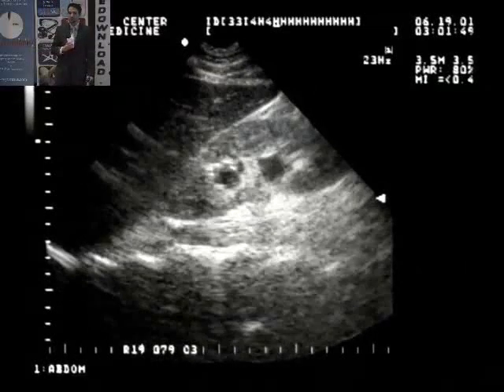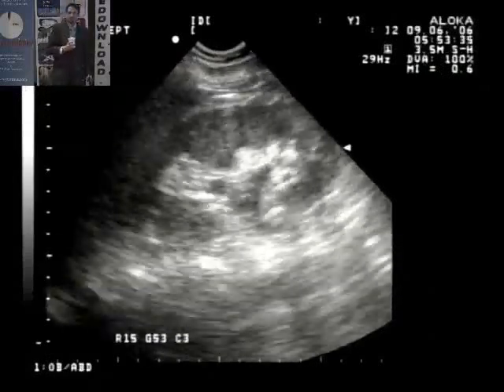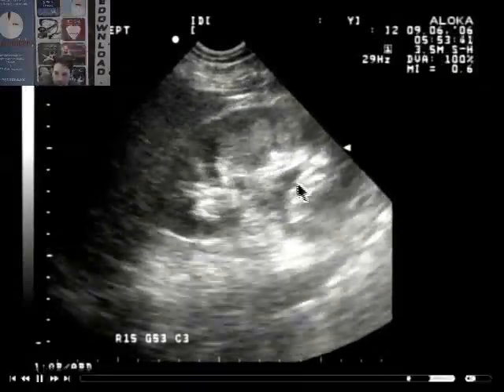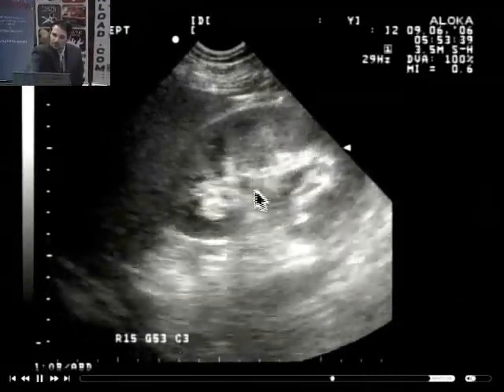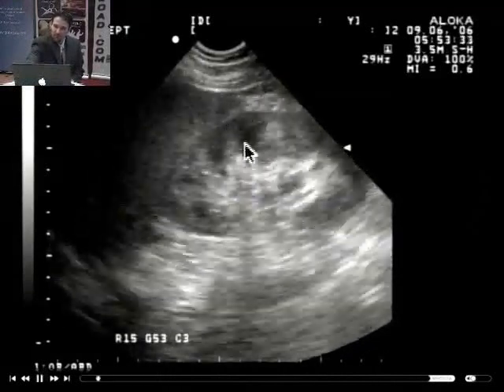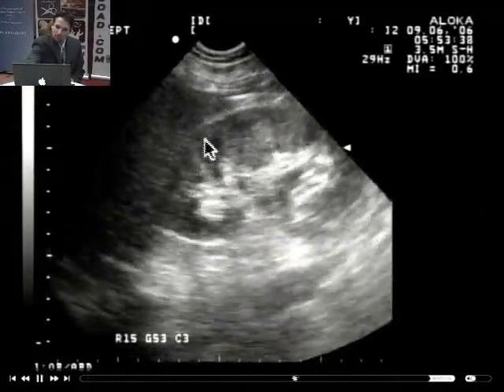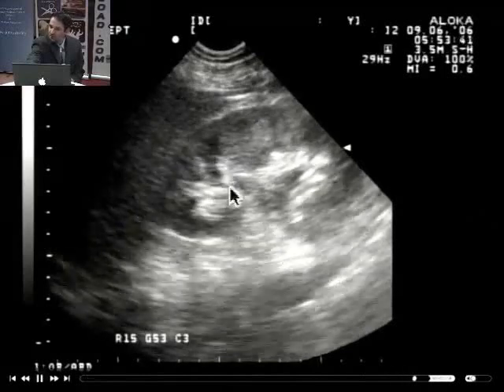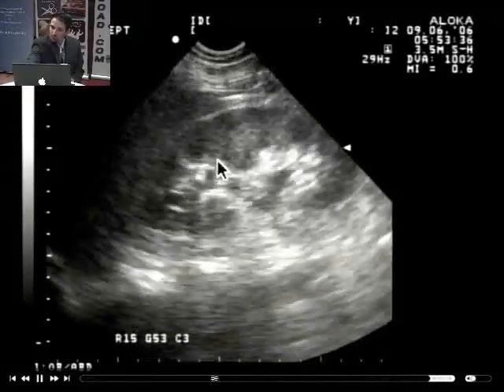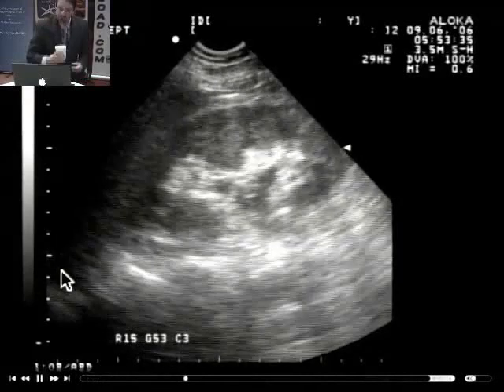Again, an example of some small amount of fluid that's built up on the kidney. Again, a small amount of hydronephrosis, just down here. So this will be mild hydronephrosis. This is the normal white sinus, and this is the cortex and medulla. What you do see on this clip are the renal pyramids, which are these dark structures out in the perimeter. Notice that hydronephrosis is going to collect centrally. These dark structures on the outside are normal renal architecture. So you're going to be focused on this white portion of the kidney and the black that collects in the center of that.